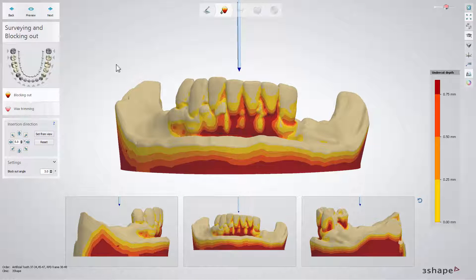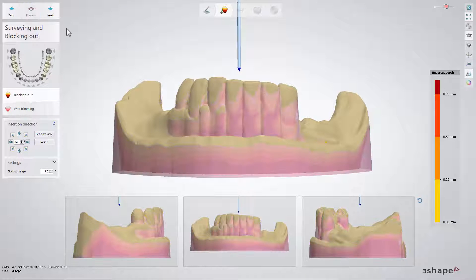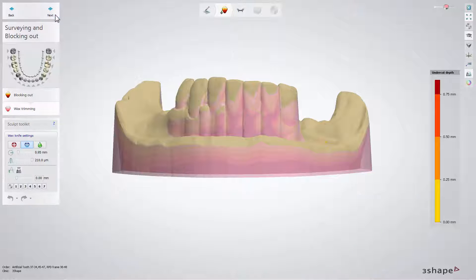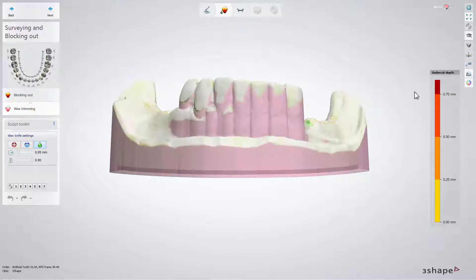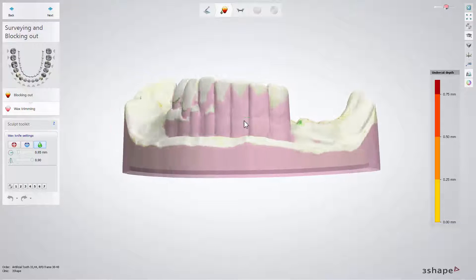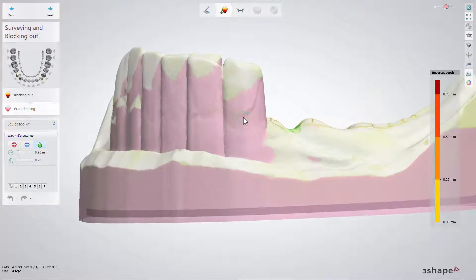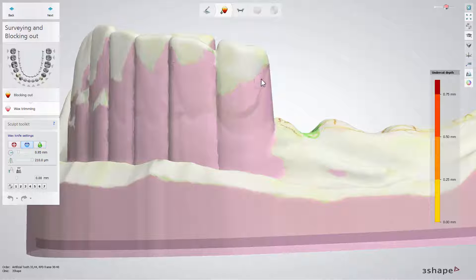Click Preview to block undercuts with wax. If you are satisfied with the result, click Next. Trim wax in the places where the clasp's retaining parts will be located. To do that, use the Remove button.